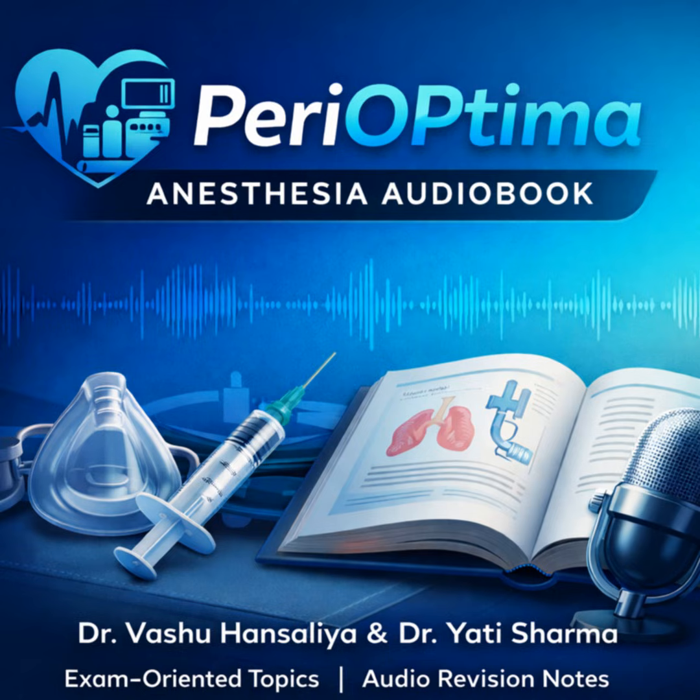So this is more recent. Much more. The real shift started in the 2000s. A key figure was the Canadian surgeon John A. Pacey. In 2001, his big innovation was embedding a tiny camera chip into a modified Macintosh blade. And that became the Glidescope. That became the Glidescope, and it fundamentally changed the game. It introduced this idea of indirect visualization. The ability to look around the corner. That's the perfect way to put it. You're no longer fighting for that straight line of sight. Knowing that history really helps frame where we are now.